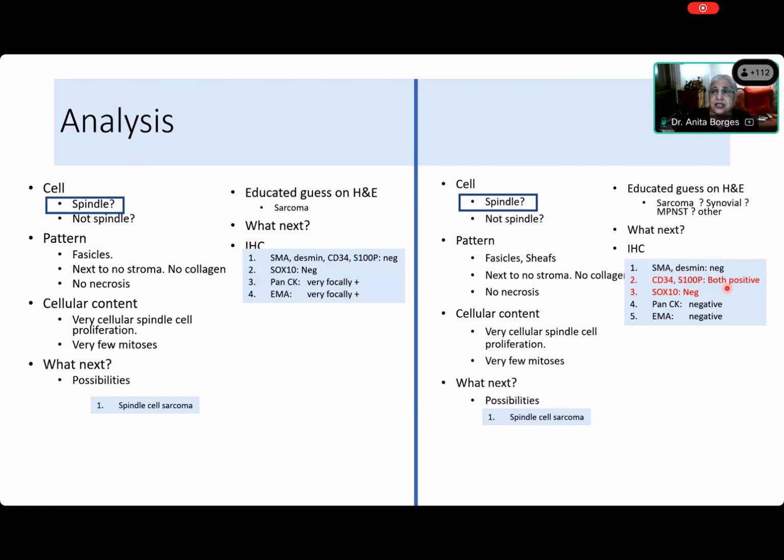If you see a very cellular spindle cell tumor, albeit that it is monophasic, yes, you must think of it. If all this SMA, Desmin, 34, S100 protein, SOX10 are negative, the next thing that you have to do is cytokeratin and EMA. Okay, so we did it. And we did everything on the other one because that could as well have been some kind of synovial sarcoma, although to our great surprise, we found that 34 and S100 protein were positive. Okay, PAN-CK and EMA were negative on this case.